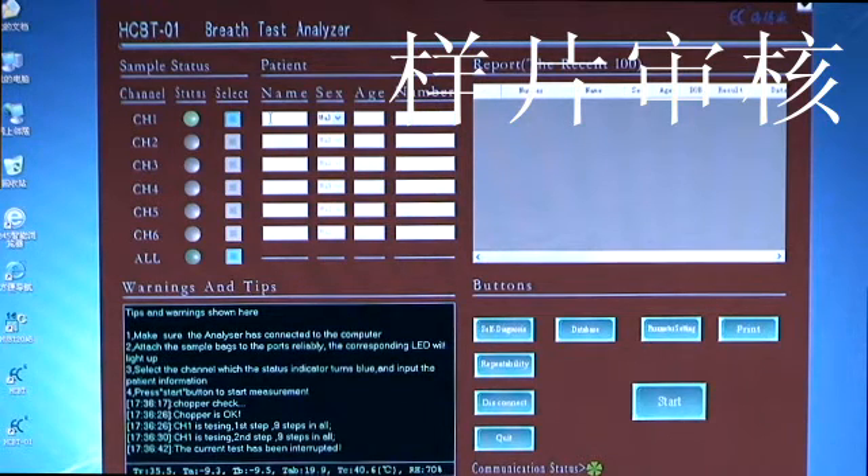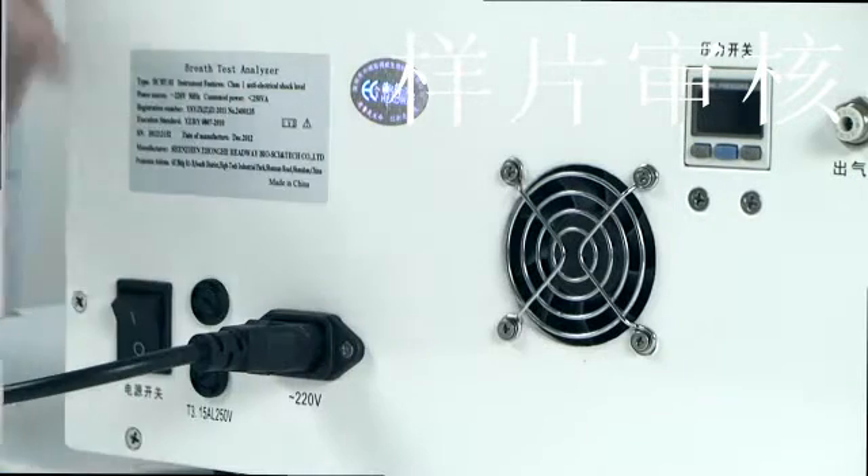2. Patient Information Column: this column is used to input personal information. If no information is entered before measurement, the default values will be stored in the database upon completion. Default value for name is a base character; for gender, male; for age, 0. The default number is a 4-digit year, 2-digit month, 2-digit date, and 6-digit time when measurement finishes. For example, if the measurement finishes at 15:30:30 on January 1, 2010, the default number is 20100101153030. Once numbers are input, they will be saved as the default value.